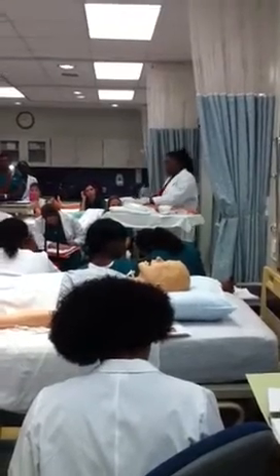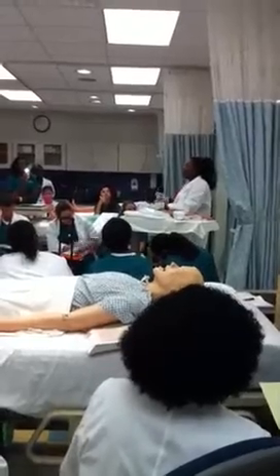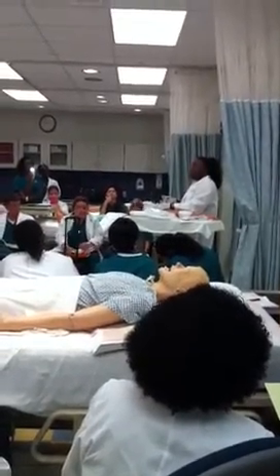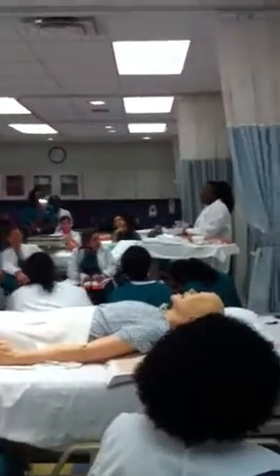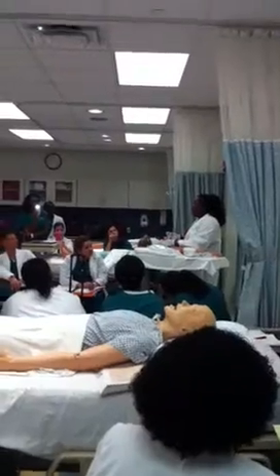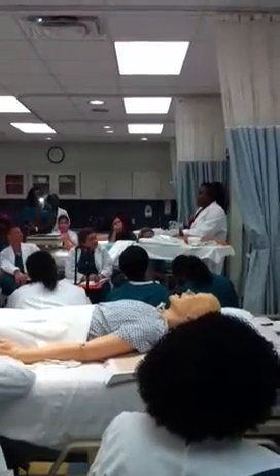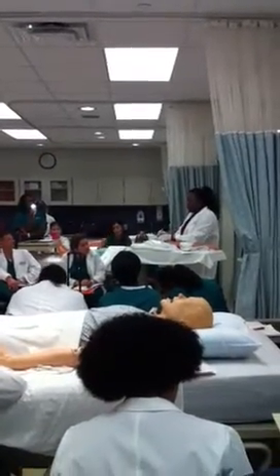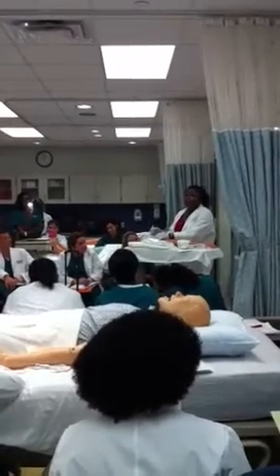All right, I've wiped. Okay. Now, with insulin, now it's good. It used to be 45-degree angle. Now you don't even need to try to remember which one is 45, which one is 90. It's recommended now that we can give any sub-Q at a 90-degree angle. I am definitely at a 90-degree angle. Is this 90 degree? No. If I give it like that, it's 45 degree, which is okay for sub-Q.